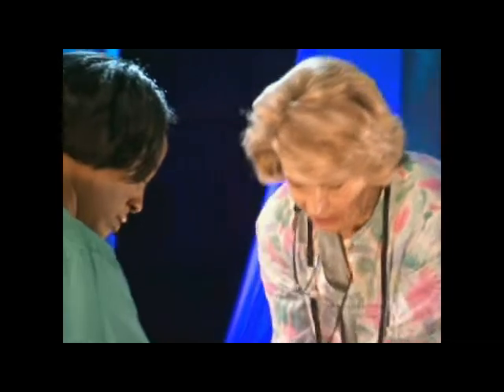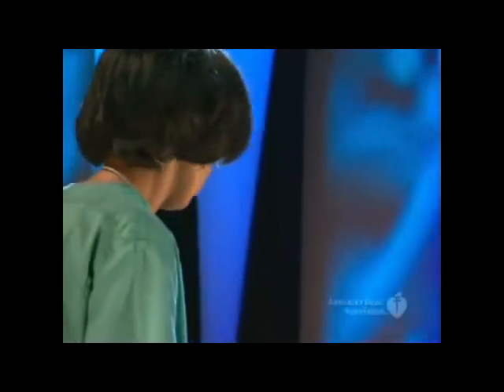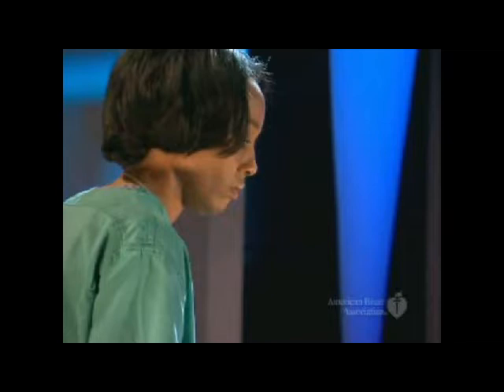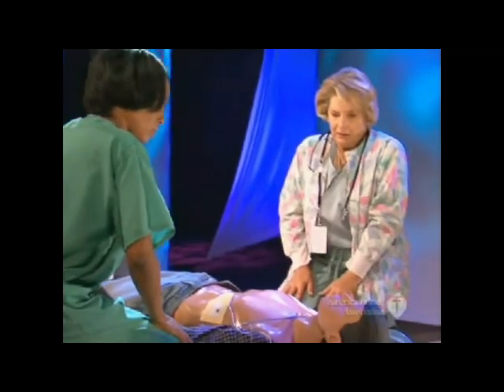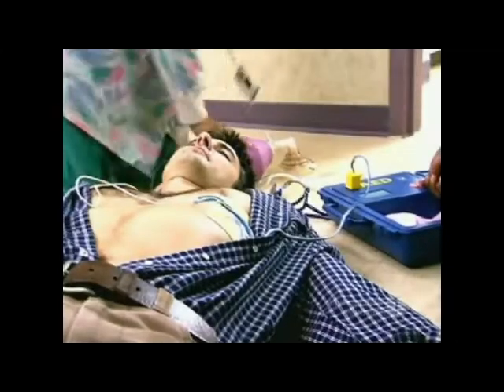Analyzing heart rhythm. Say clear. If the AED finds a heart rhythm that can be treated with a shock, the AED will tell you so. Shock advised. Stay clear of patient. Deliver shock now. The AED will then tell you when to push the shock button. I'm clear. You're clear. Clear. We're all clear. When the shock is delivered, the victim's muscles will jerk.